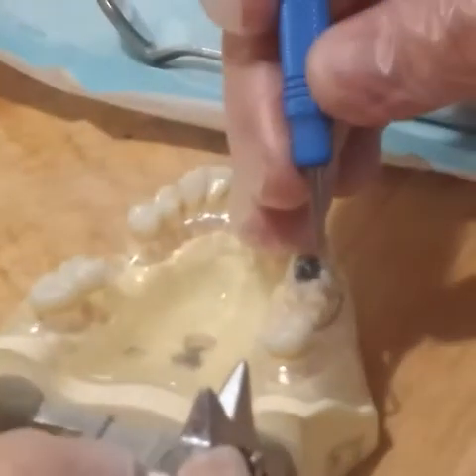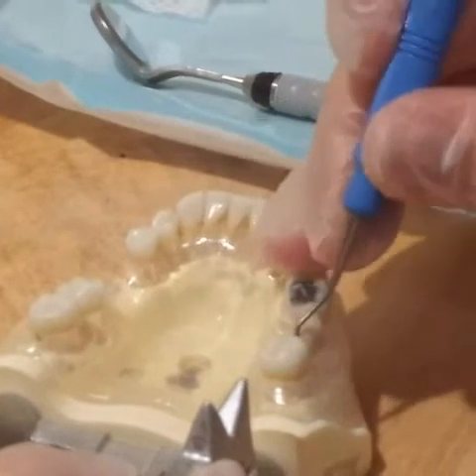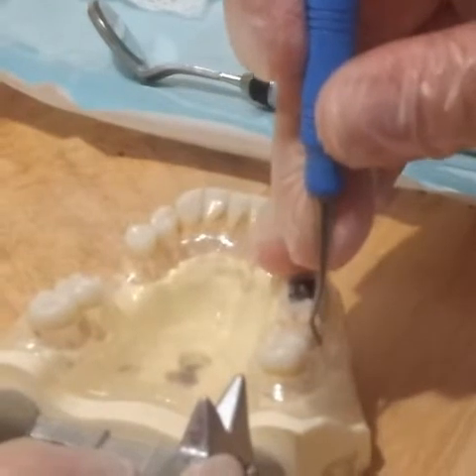If you do not locate any calculus, continue using the same technique in sequence and move to the next tooth.